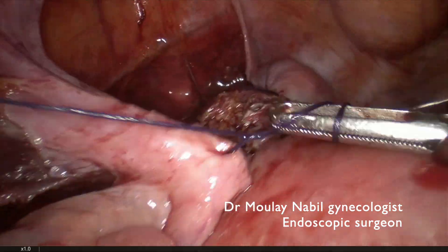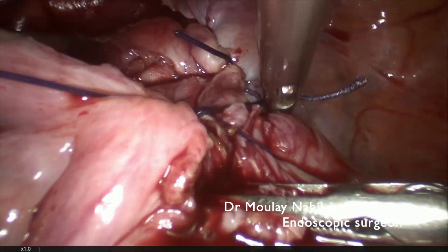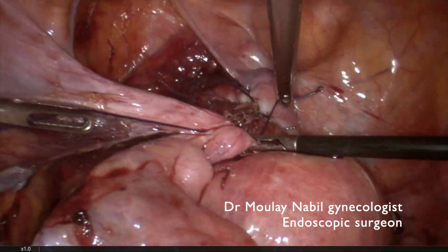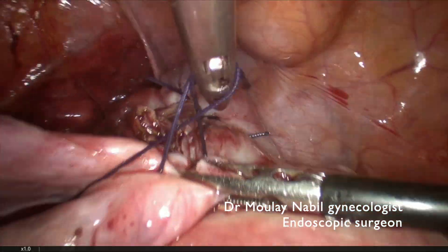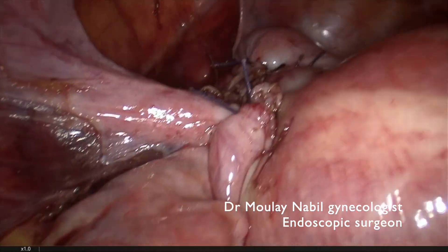You can see the procedure — even with a 12 cm myoma — is completely bloodless and quick. It's important for this kind of surgery to have a well-trained assistant or nurse to perform this procedure safely, quickly, and in a bloodless condition.